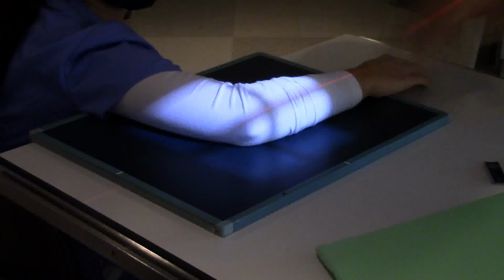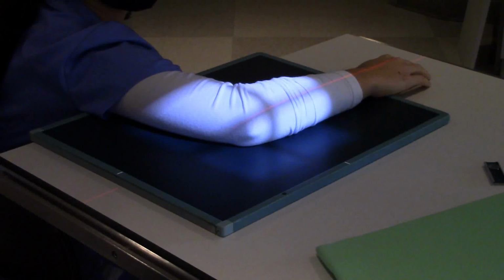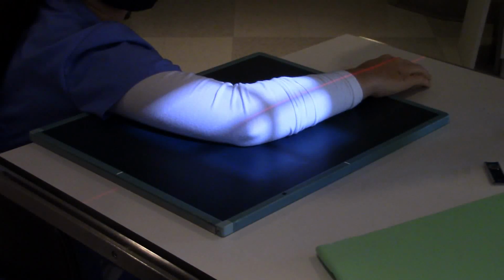Now that I'm over here, I think you're okay. See where her, you're just up above the elbow. I think you're fine. So you go over and down? Yes. Okay. What you said.